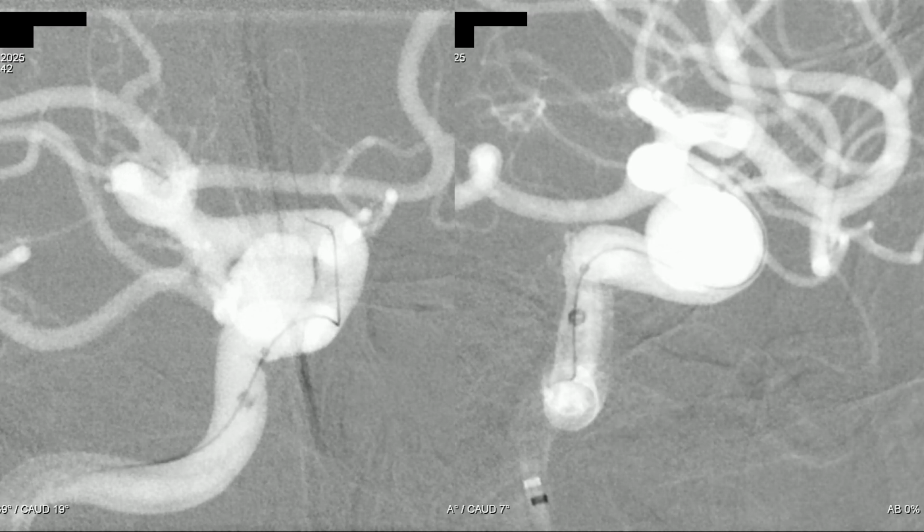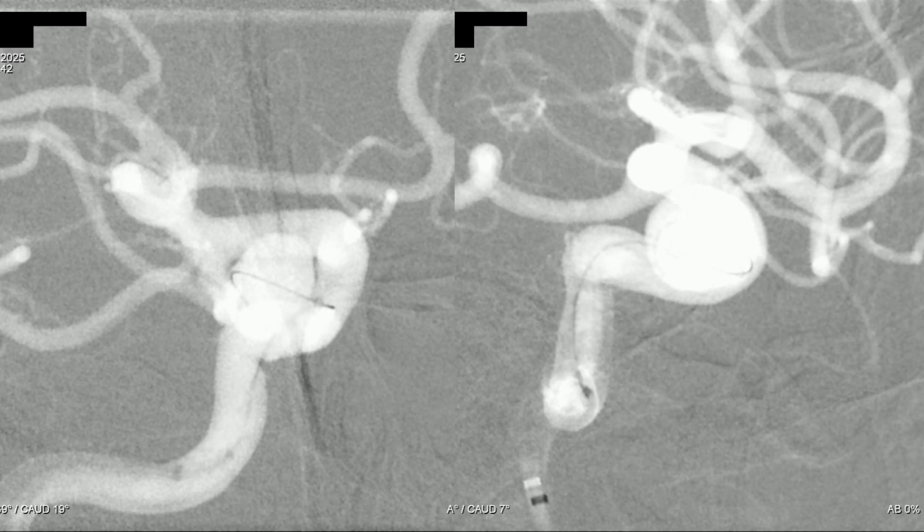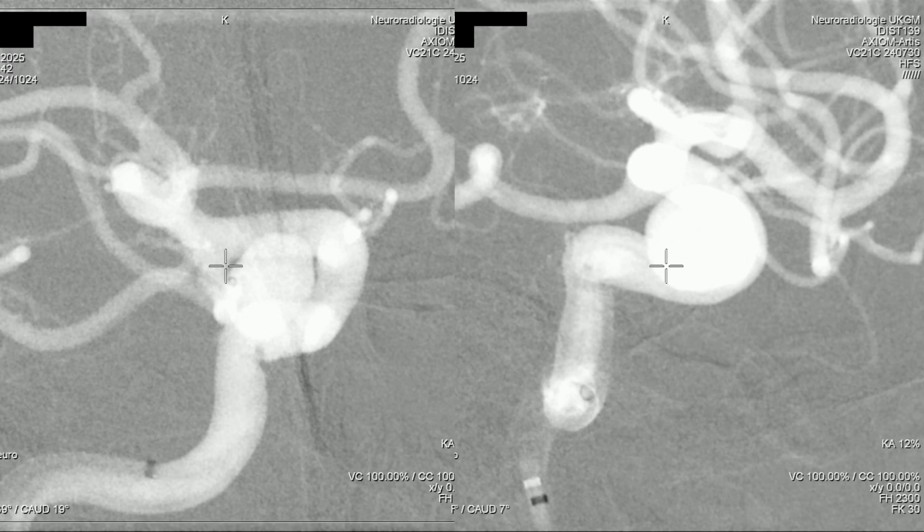We push the microcatheter a little bit distally and pull it back and try it again, and as you can see, it doesn't work. That's why we make a loop with the microwire inside the aneurysm sac and then push the microcatheter inside the aneurysm sac, and now we are inside the aneurysm sac.